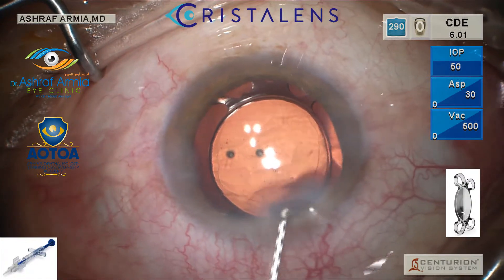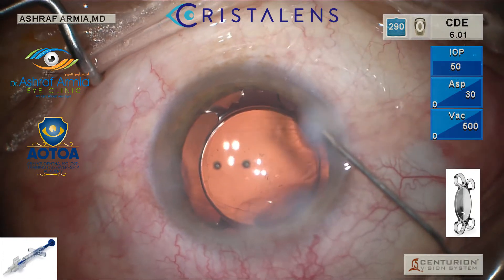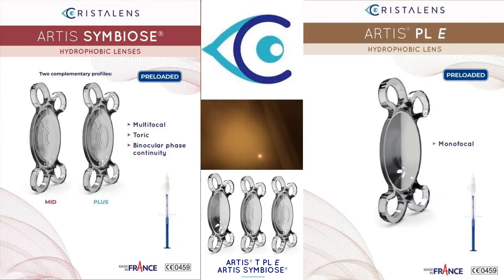Then hydration. You can see how it's centered inside the eye and the anterior edge of the rhexis is covering the optic. After you finish, just hydration — very nice.